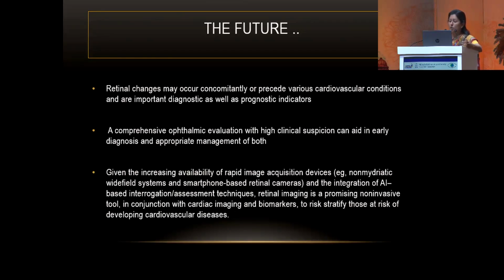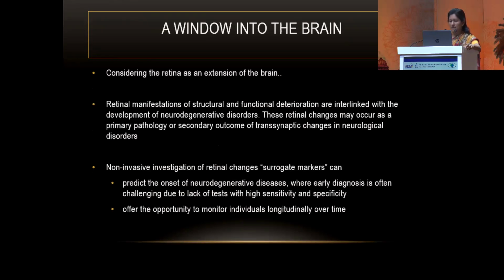So along with a lot of cardiac imaging and cardiac biomarkers, there is now a system to risk stratify those patients who are at risk of developing either heart failure or stroke, and retinal imaging is a part of that scoring system. In fact, in many of the service hospitals, I'm aware that the cardiology department, without our intervention, has the non-mydriatic smartphone-held fundus cameras, and they are using this to stratify their patients as well.